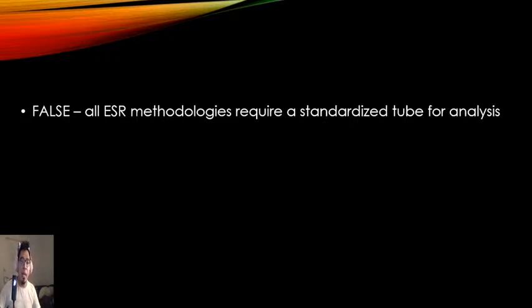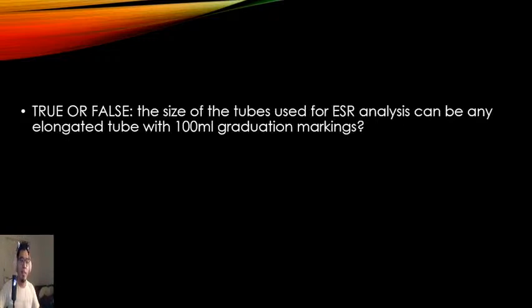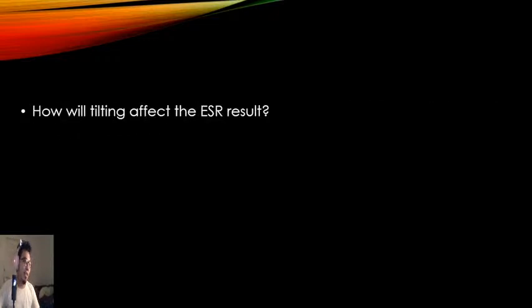So, doon pa lang, Sir Marco might be testing your knowledge on ESR. So mali yung ginawa ni Adrian, in my fictional view, na sasabihin na, well, all right, sir, I'm going to do it. I'm just going to put 100 ml graduation on the tube because obviously that's what Sir Marco said. So, ganon. Alright, now, how will tilting affect the ESR result?